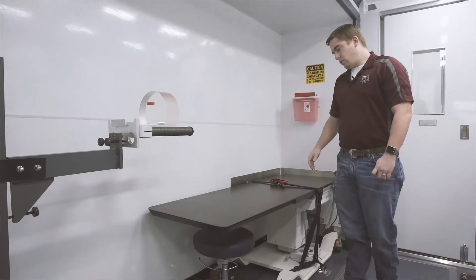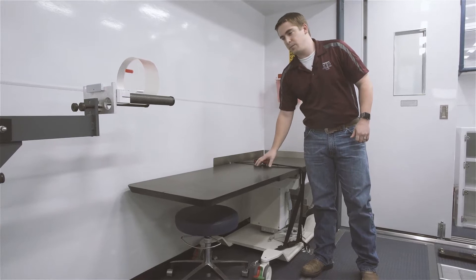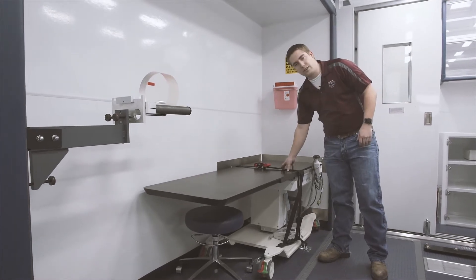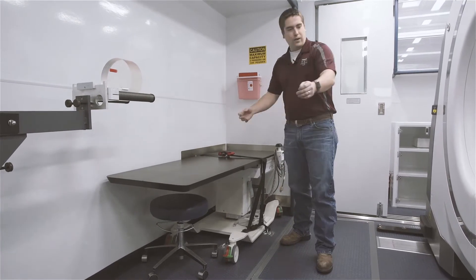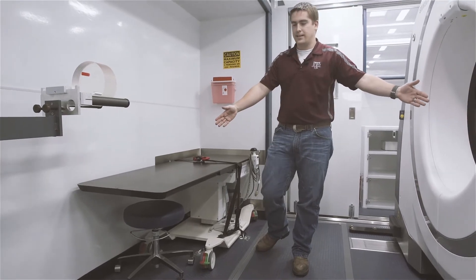The two things that we store here are the table that the patient is going to be laying on for the scanner. This is a specially designed table for the width of this unit. It's currently in its transport mode, so it's locked into place with this strap right here. When it's ready for use and they're on scene ready to deploy it, we'll take that off, swivel it around, and the patient will be laying in this left-to-right position ready to scan.